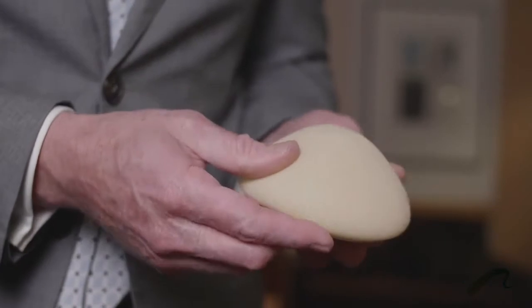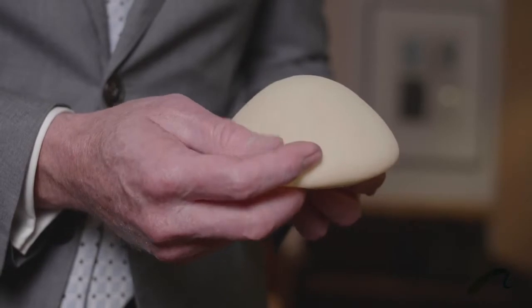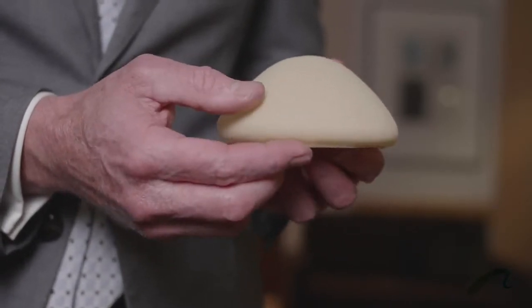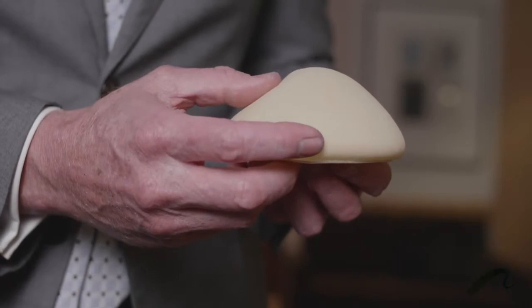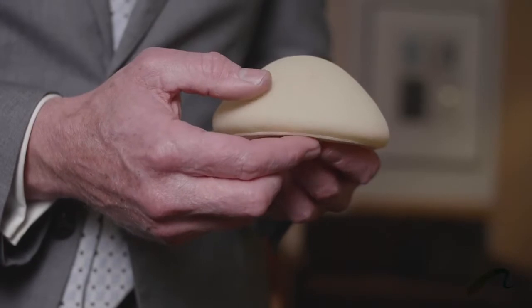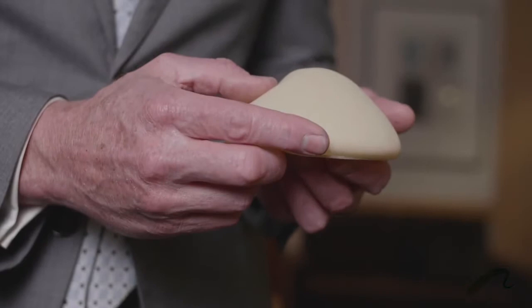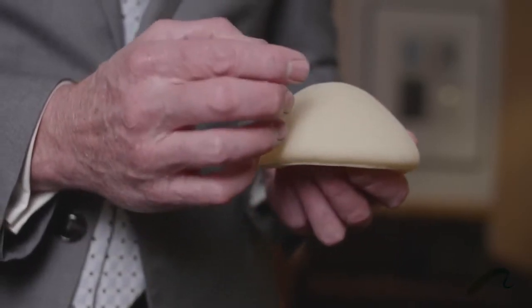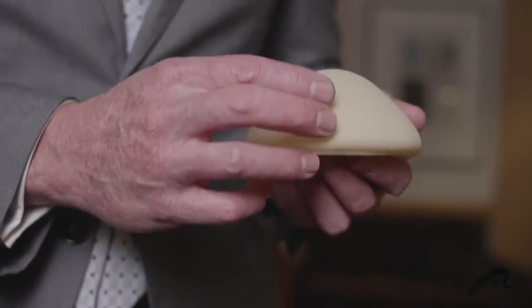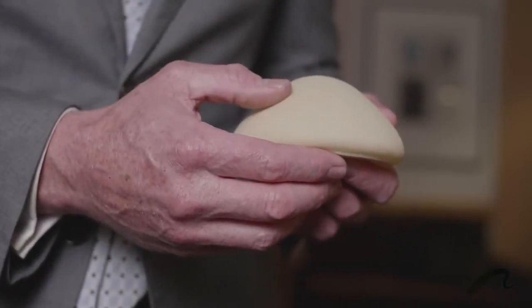You might have heard of one other type of implant, and that's a polyurethane implant. Now, these implants are really quite different to all of the others. They're covered by a polyurethane texture, which makes them very furry. And we tend to use these in that situation where we're trying to deal with a pre-existing medical problem, say recurrent capsular contracture, or an implant which tends to prolapse and move into a different part of the breast to where we want it. So when we put these implants in, they're very, very sticky, and so therefore they're difficult to use, but they often can get us out of a problem situation where the other types of implant simply won't do the job for us.